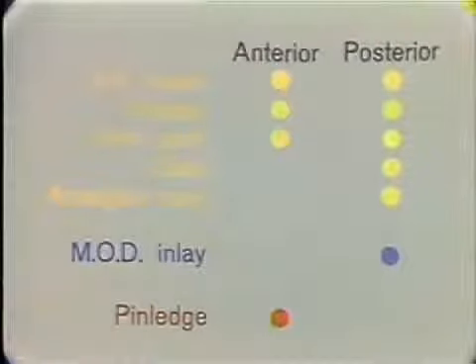The cast crown is an all-gold complete crown, which of course is only used on posterior teeth where the aesthetics are not critical. The amalgam core crown is used on vital teeth where a great deal of tissue is missing and a core is built up in amalgam which is retained in position with pins, and is used mainly on posterior teeth.